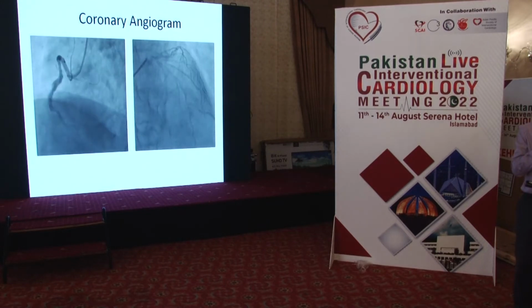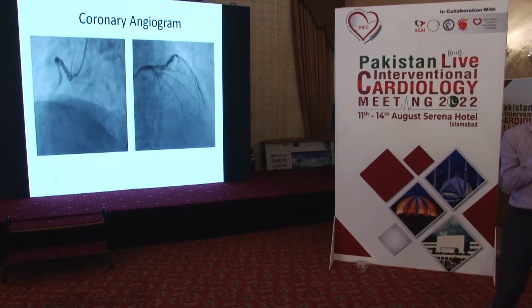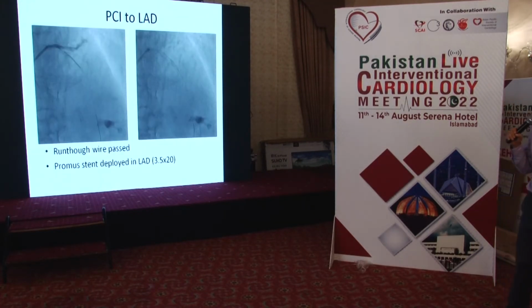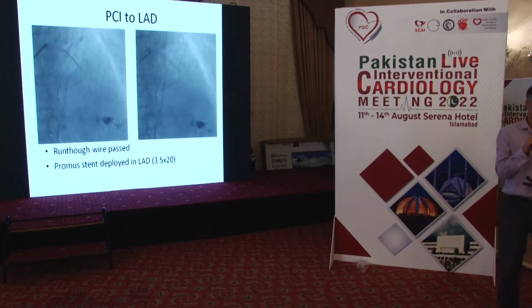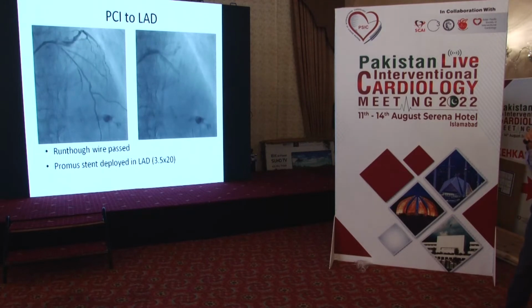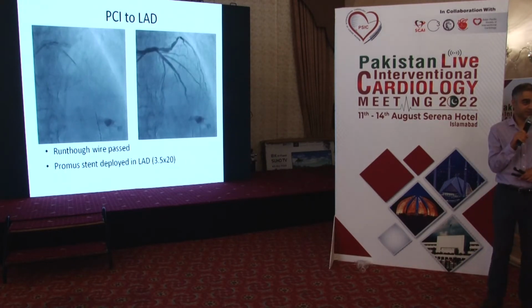So what size stent are you going to put into this vessel? 4 millimeter? Proximal LAD, young man, yeah. Okay, not an unreasonable suggestion. Next slide, please. So I put a 3.5 in here, and I went with a 20 millimeter length of stent. So that was put through, and what you can see and probably appreciate is slightly sluggish flow in that septal after that. What's going on?